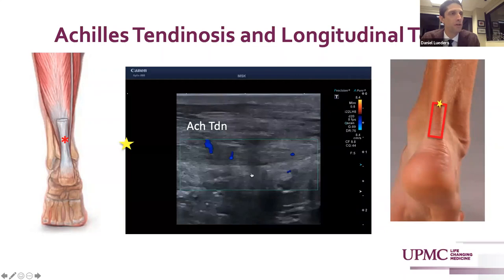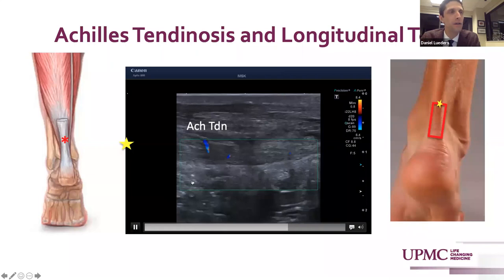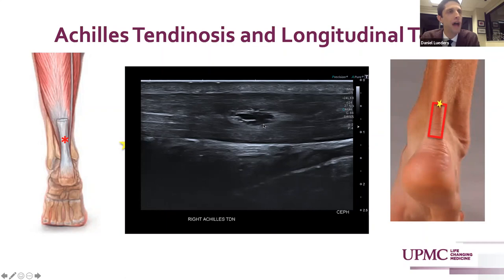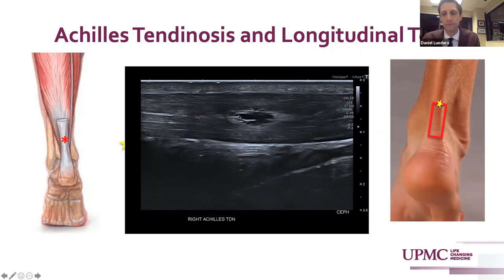Pathology in the Achilles tendon can often involve ingrowth of neovessels and neonerves from the Kager's fat pad into the tendon and potentiate pain. In that anatomic long axis view, turning on your color Doppler or superb microvascular imaging can identify vascularity growing in from the fat pad into the tendon. This is an unusual case — there is tendinosis here, but quite distinctly there's a large hypoechoic cystic-appearing structure in the intrasubstance of the Achilles tendon. This was a delaminating split thickness tear of the intrasubstance of the Achilles tendon that contained almost a serous fluid, but without a full thickness tear.